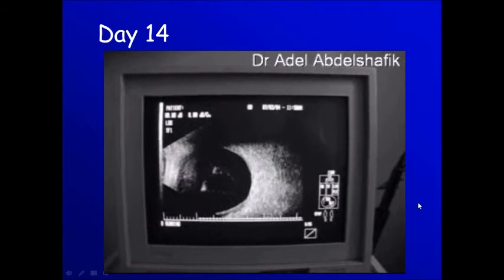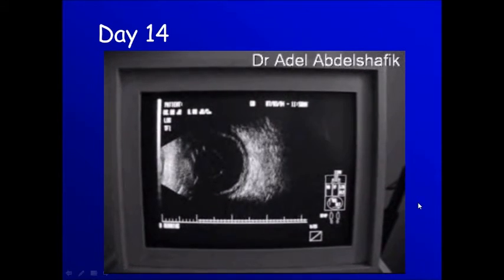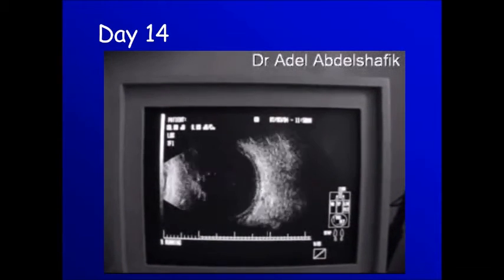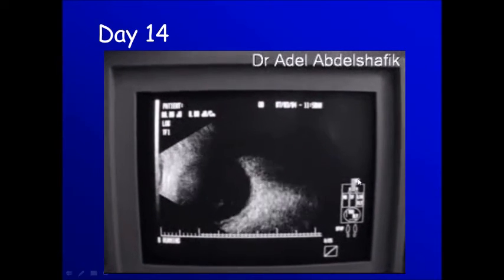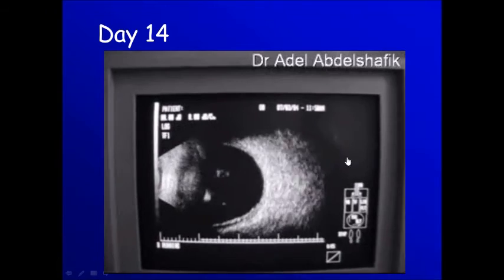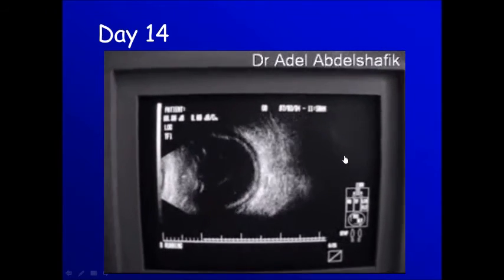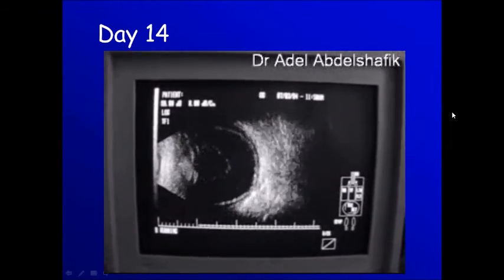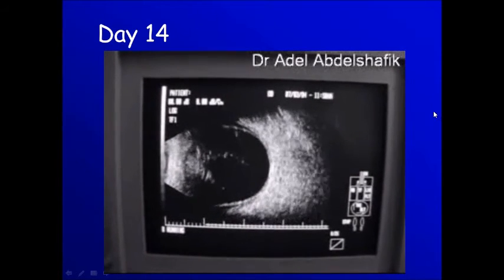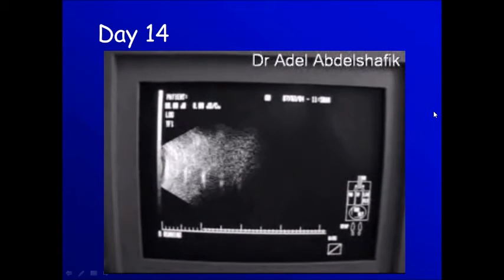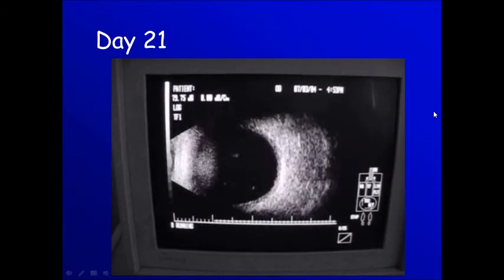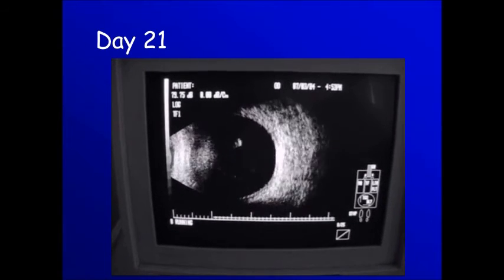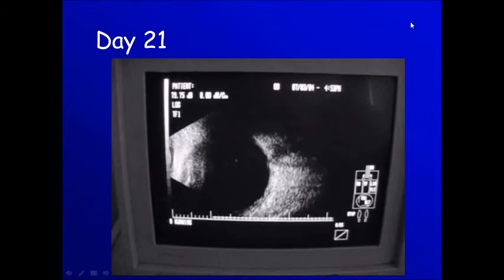Two weeks after, you can see most of the choroidal detachment has disappeared; we still have some small space between the choroid and the sclera. Now, after three weeks, there is total absorption of this hemorrhagic choroidal detachment.